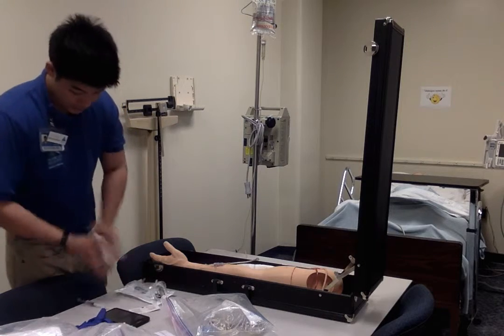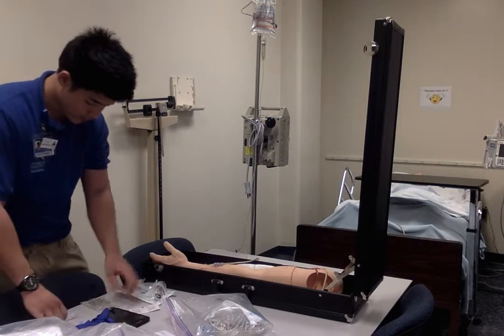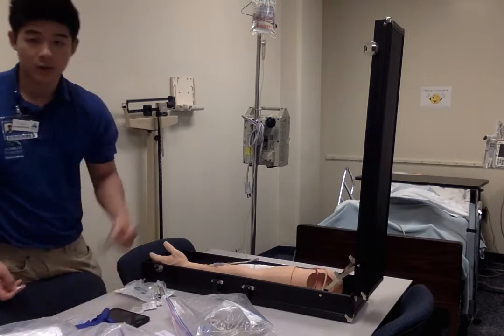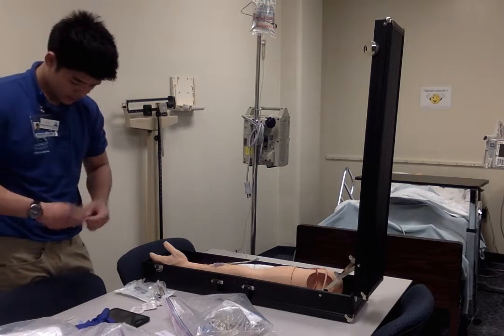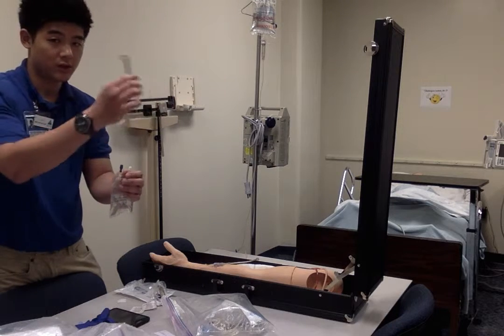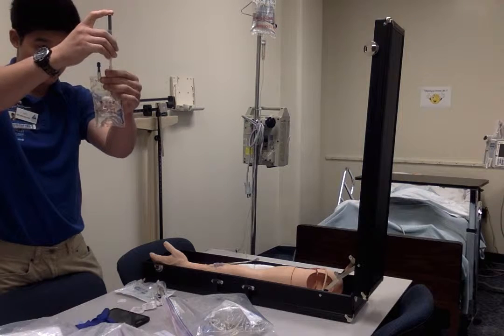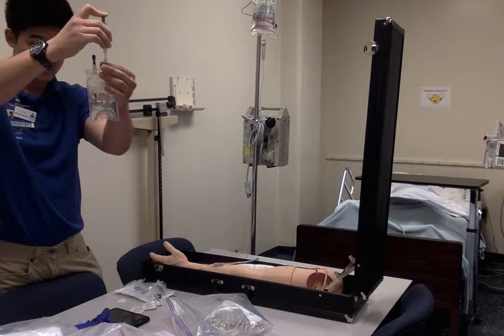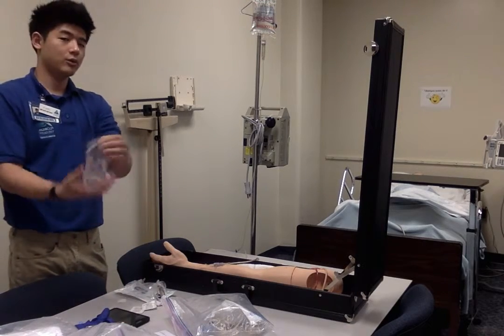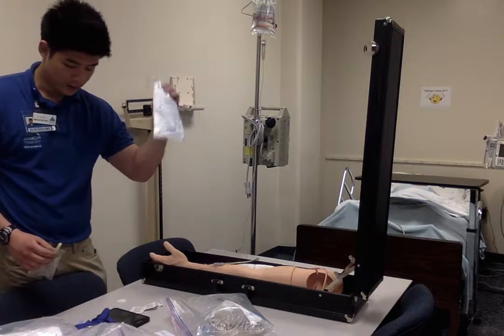Okay, so let me do my hand hygiene first real quick. I'm going to wipe the port. Now putting 2 milliliters of vancomycin in here. Going in well. Take this off. Go ahead and shake it real quick. This is good. Here's my secondary tubing.